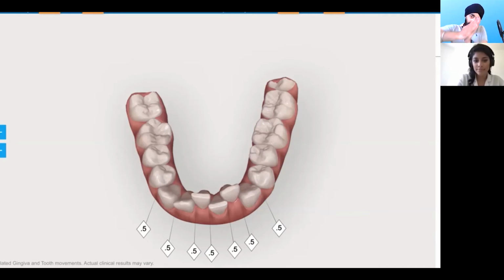It might be at an angle. It might not be completely adjacent to the tooth, especially after the first visit. Yeah, no, they can be tricky. You have to put them in at a certain angle to get them down, because especially in between the laterals and the canines, canines are so bulbous, so you can sometimes have quite a tight contact point there.